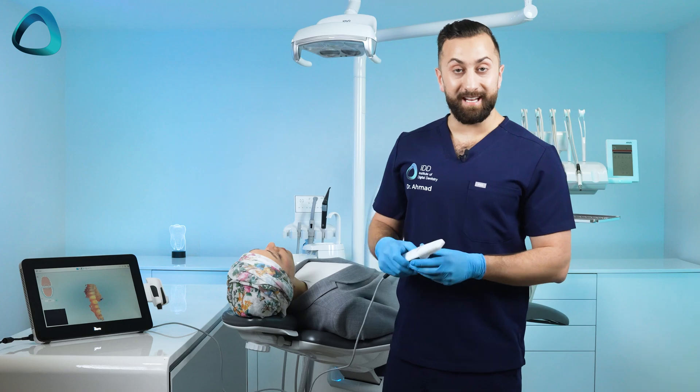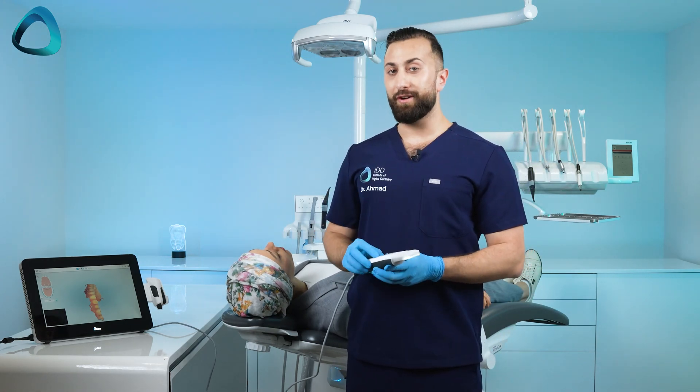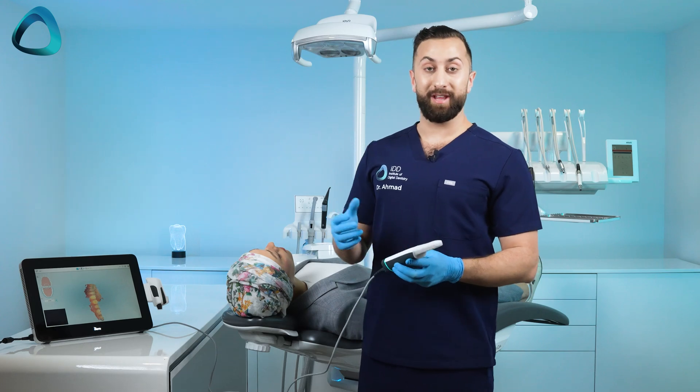And that is the lower arch scan done. As you can tell, a lot faster than the previous generation iTero scanners. So now let's do the upper arch.